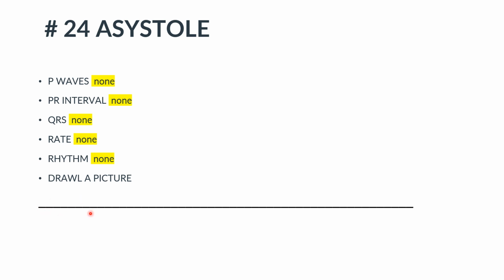So when they go into VFib, at first it's very chaotic and you're going to see a lot of changes. But as the heart starts dying more and more, you see how I'm quivering, but it's not as much. All right, and so this can look suspiciously a lot like this right there. And so you don't want to say, oh yeah, they're in asystole, don't zap them, when they're really in VFib. And if they are in VFib, they can respond. Obviously, gross VFib, the big waves, are way more likely to respond than just the itty bitty little waves. But hopefully that helps.